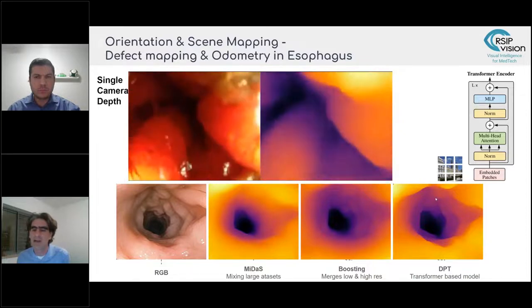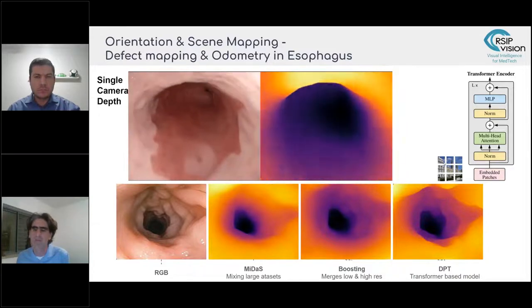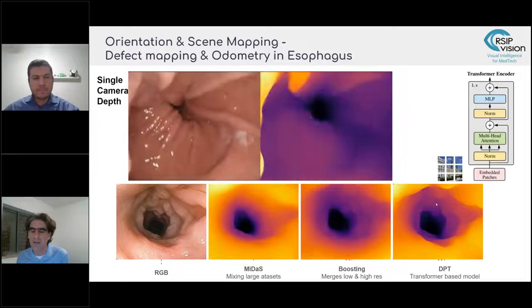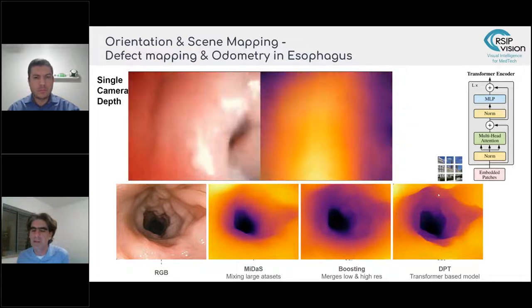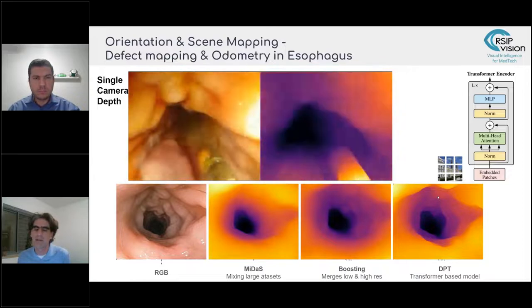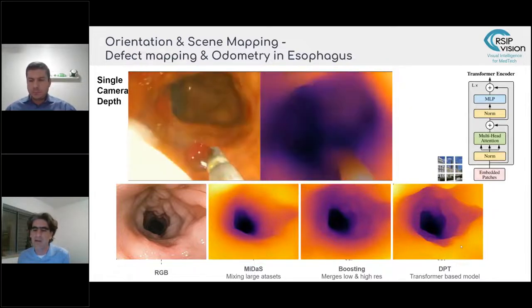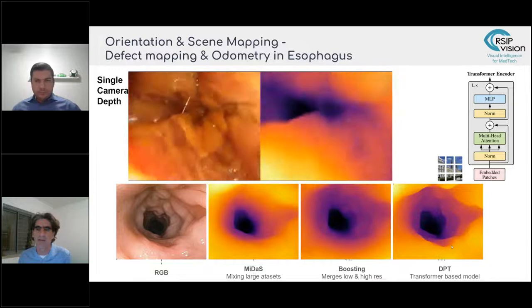And in the visual domain, what we see is that this enables these sharp edges to be picked up. Because we get rid here of the bias, this is using only patches, it's not using convolutions at all. Because this network architecture gets rid of the local bias, the assumption built into the convolutional architecture that the desired response at a typical pixel is dependent on its nearest neighbors, you get these sharp edges, and you also can get the long-term dependencies. So we know that this area of the scene here, which is fairly flat, the system can learn that it is indeed flat and not to blur the edges between the different areas.